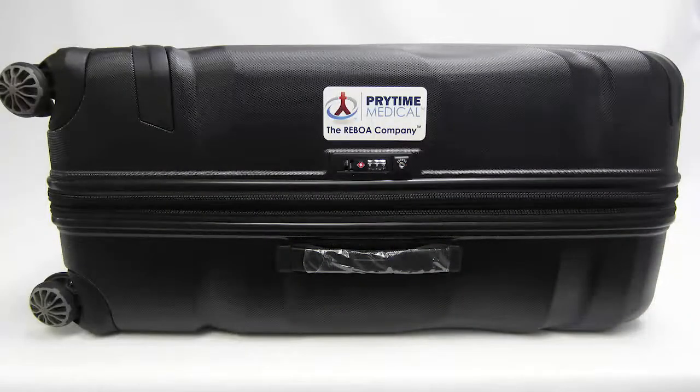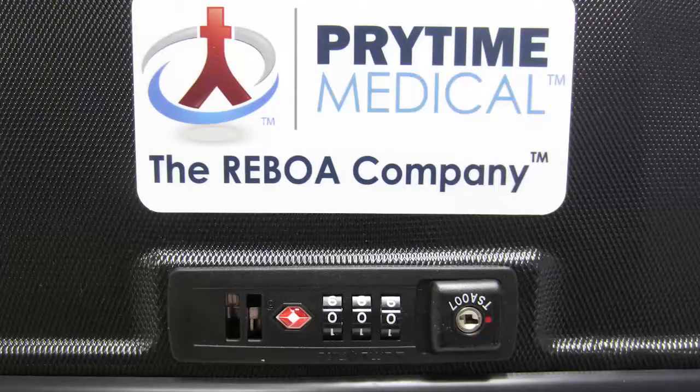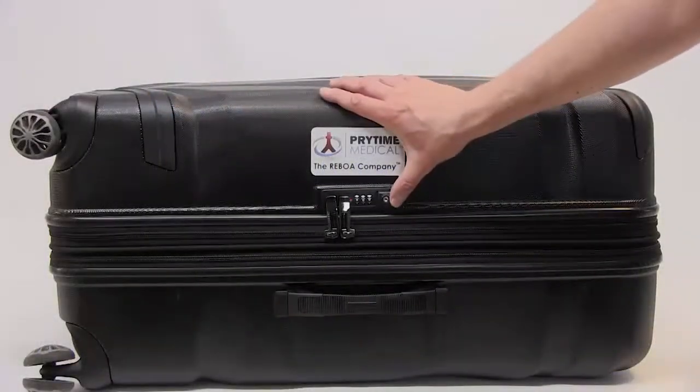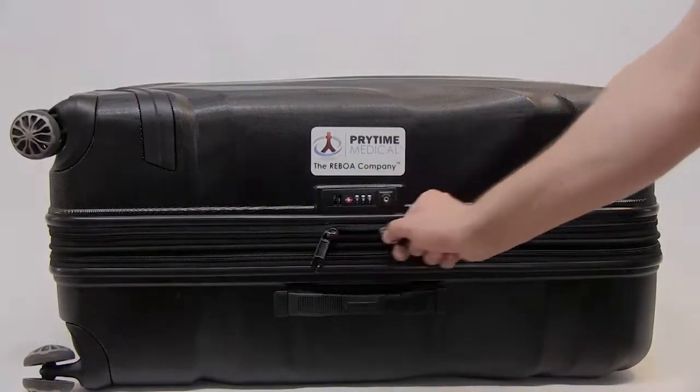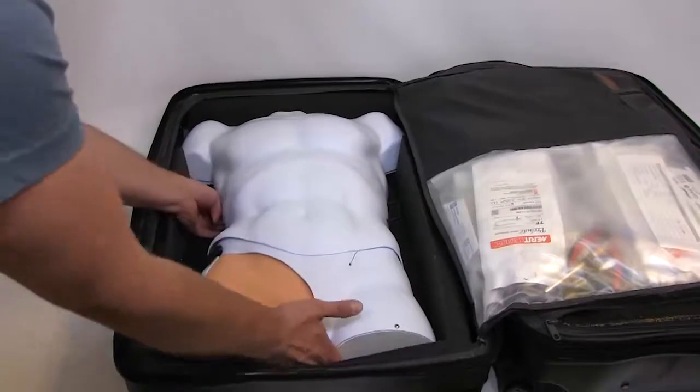Unlock the case containing the STAR by turning the combination to zero zero zero and then pressing the zipper release button in towards the combination dials. Remove the body model from the case.